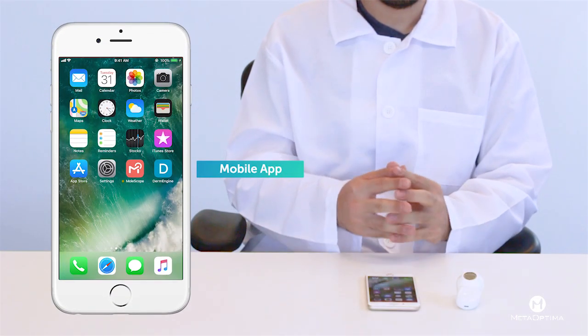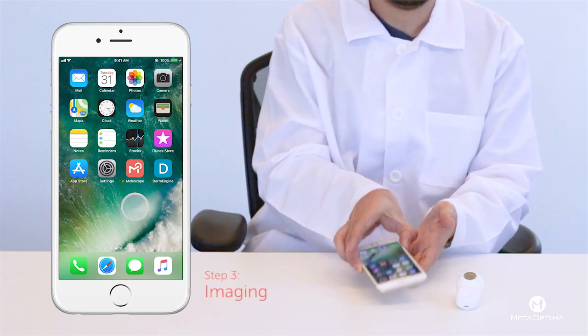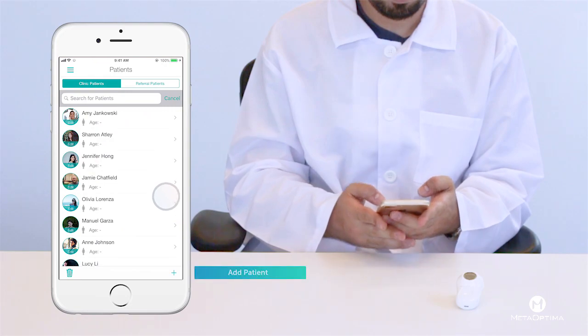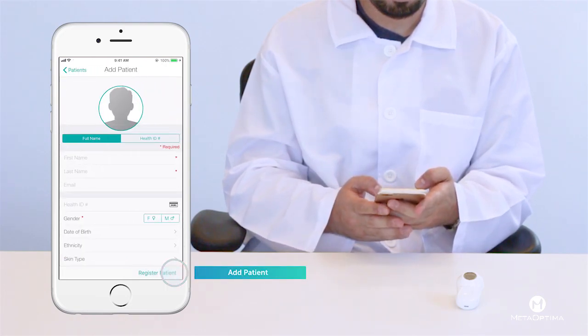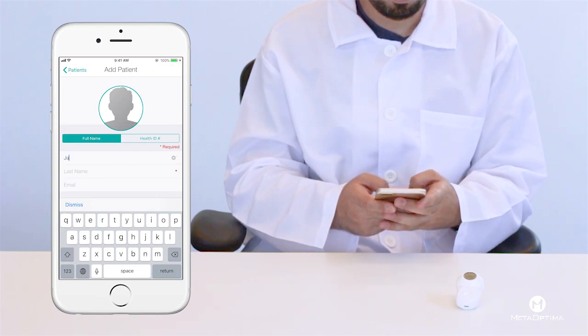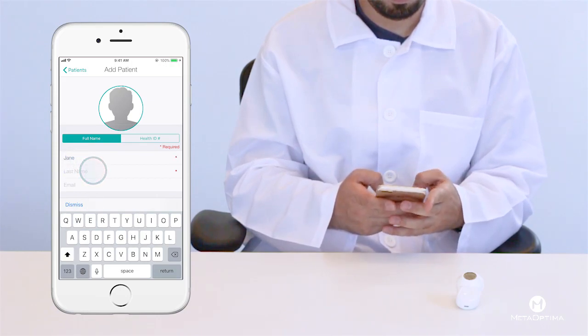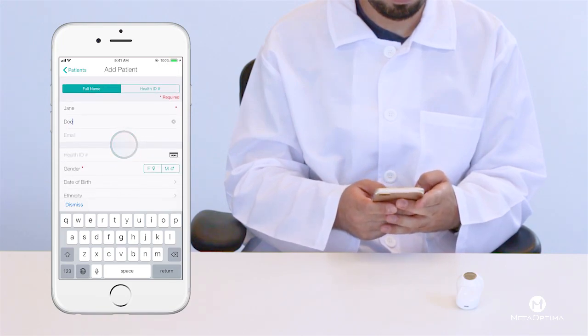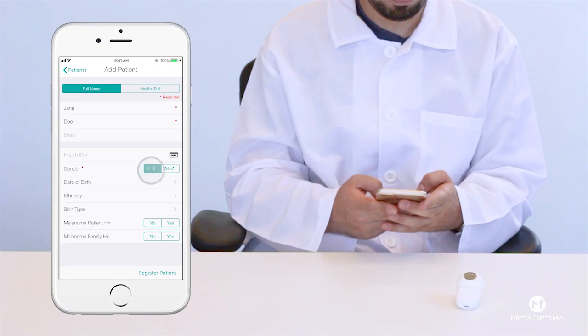Over to the Molescope app. Once you've downloaded the app and created your account, you are ready to add a mole. First, let's create your patient. From your patients list, press the plus icon to add a new patient. A form will appear where you simply fill in their information. Once you're done, press register patient to finish.